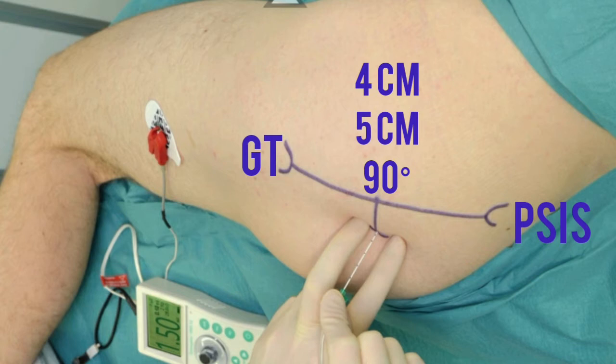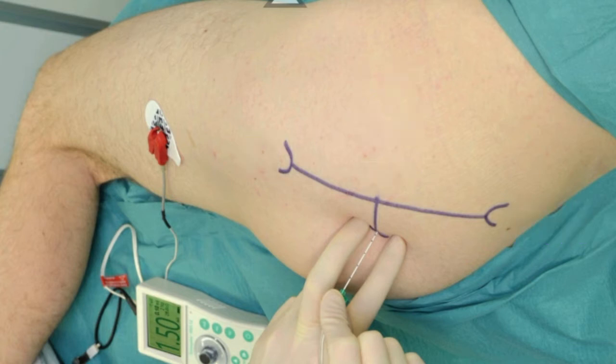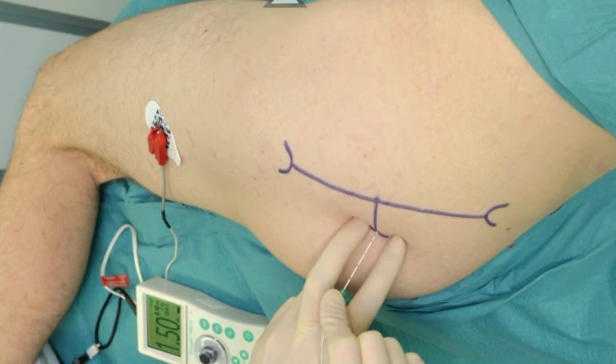Now insert the needle perpendicular to the skin for approximately 5 centimeters. That was the short version of the posterior approach of sciatic nerve block. Now coming to the details of this block.